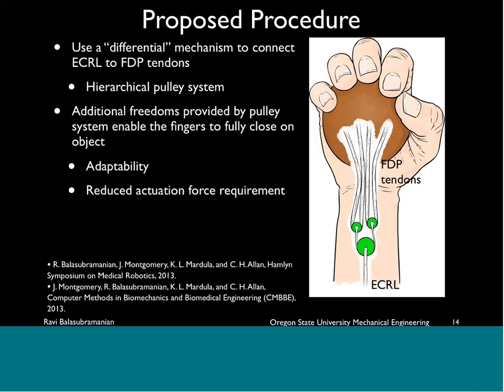We term this behavior of the fingers enabled by the pulleys adaptability, meaning that the fingers are adapting or conforming to the object shape.